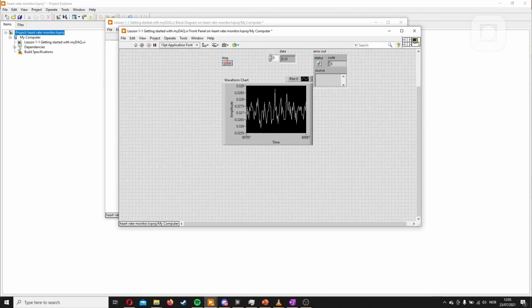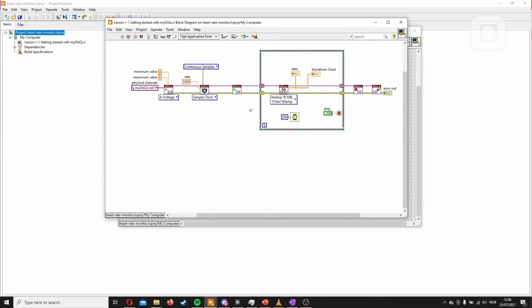And we'll stop it, and that's lesson 1.1. We have a MyDAQ working, responding to input. In the next lesson, we'll focus on getting this a bit more pretty, compartmentalizing it so it's easier to use in a larger application.